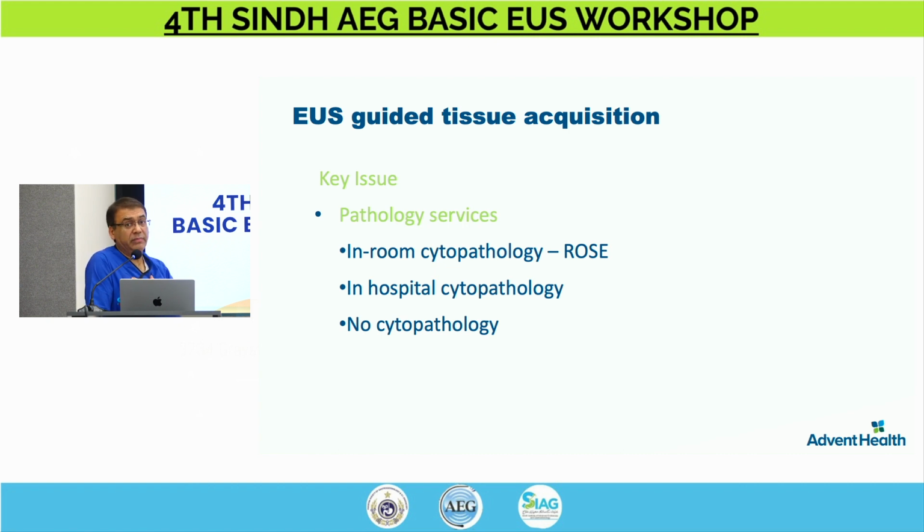But I have learned to make slides. When it's any case after 5 p.m., and if the cytotech is not available, I make the slides for my team, like anybody doing it. I make the slides, and I interpret whether we have enough specimen or not. So what I'm getting at is, you have to learn, or your technician or whatever staff is available needs to learn, how to make slides, how to stain them, and how to interpret them. That you should learn on your own, just because you don't have those kinds of resources available.